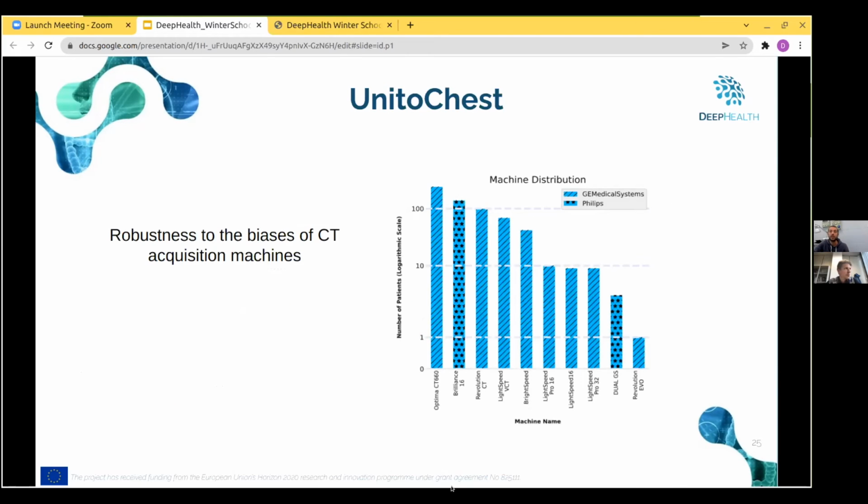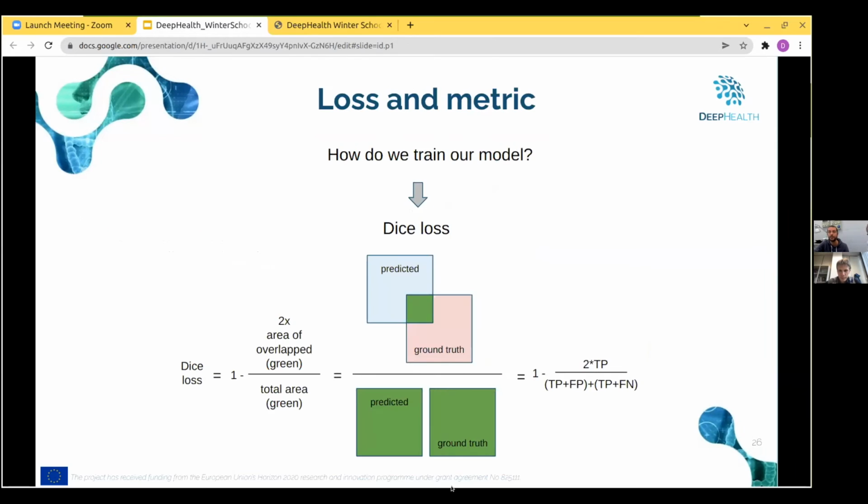Most important, the dataset is composed of images from a very large variety of CT scanning machines, as shown in the graph. Most medical datasets have a single source as image acquisition system. Each acquisition system has its own characteristics that can introduce biases into the training of neural models. In our case, the source inhomogeneity helps to counteract this bias effect.